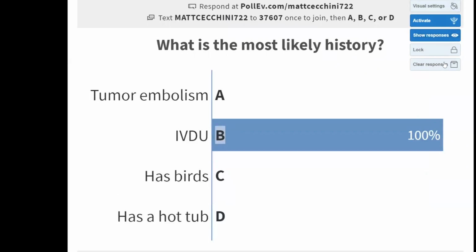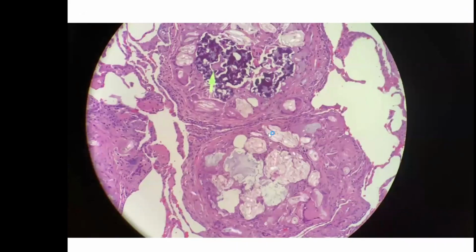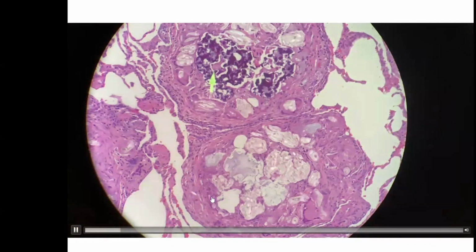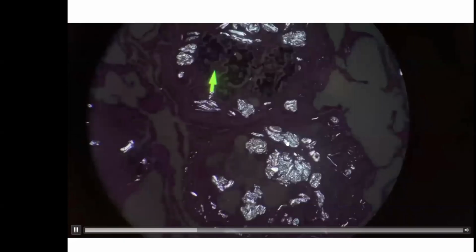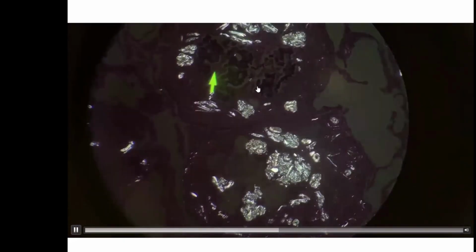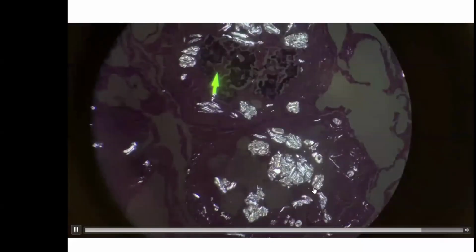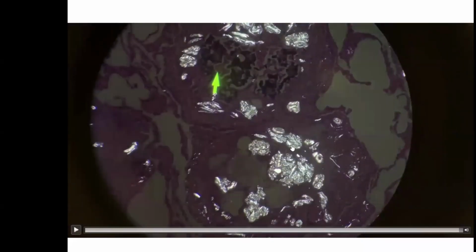Great, so perfect, everyone got it. And Dr. Mukhopadhyay has highlighted a paper in the chat as well, so if anyone wants some information on this. This is actually a case of intravenous drug use. And so I just want to go back to this video here to show you, you can actually see there's two distinct components. These pill fillers, which are usually from crushed pill fragments of people who use intravenous drugs, can often have different fillers in them.